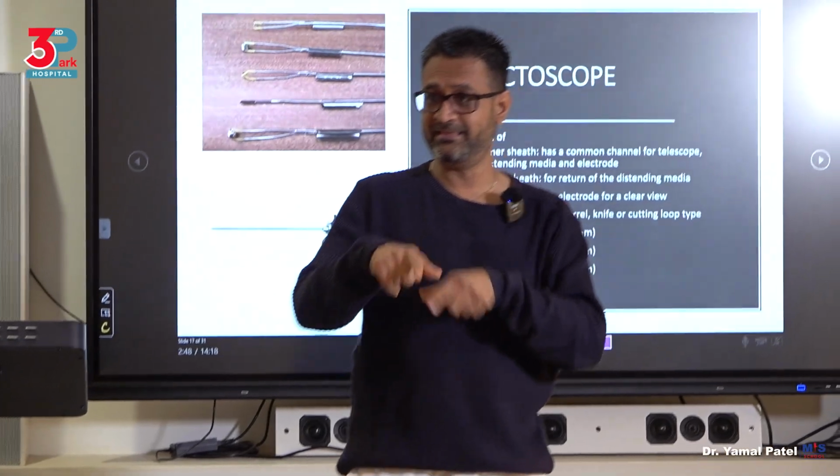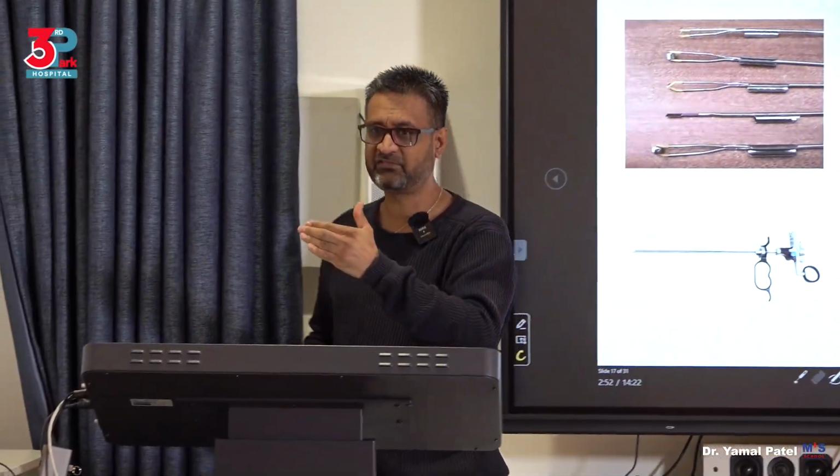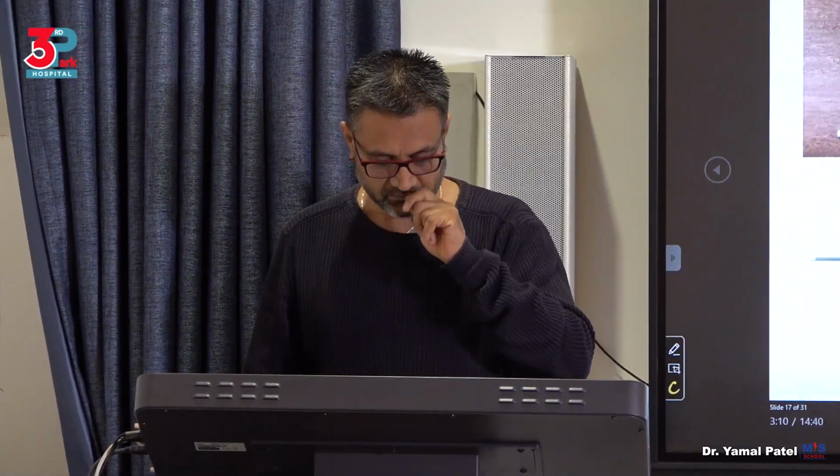You can put in the scope and see, but when you try to resect, you'll realize, okay, I'm struggling here. Why am I struggling? You'll be struggling because you're using a 30-degree scope on a resectoscope, where your electrode is rigid. You can't turn it and you're viewing something different. So that's where you'll get stuck.